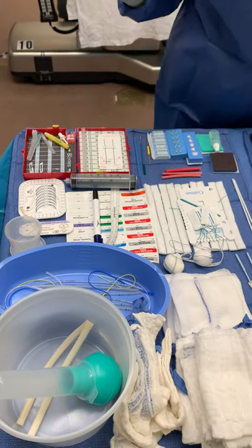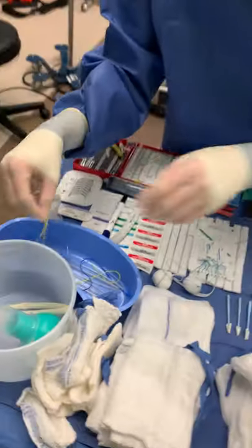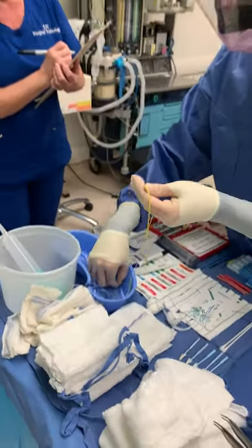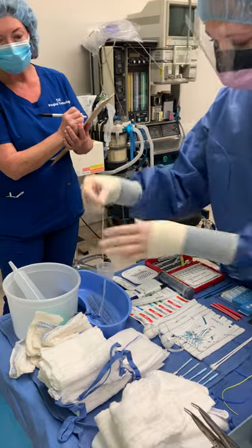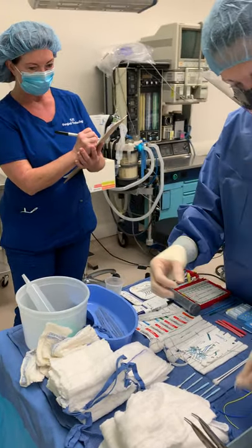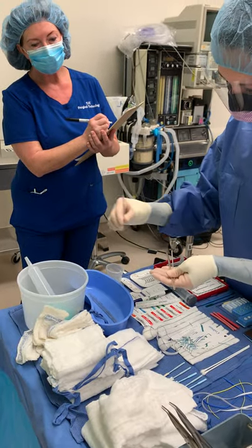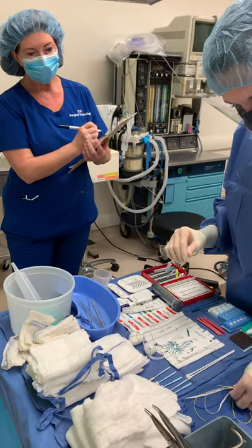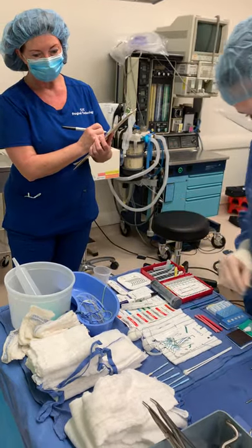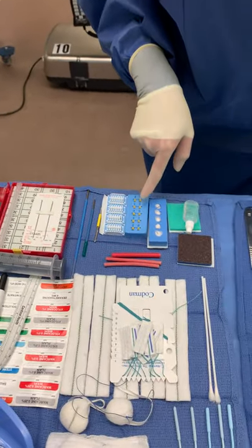And Penrose drain, I have 1. Vessel loops, I have 1, 2. Umbilical tapes, I have 1. Shunts, I have 1, 2, 3, 4, 5, 6. Suture boots, I have 2, 4, 6, 8, 10.